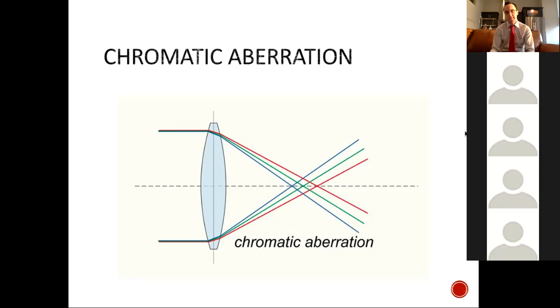And we may suggest the patient try a Trivex lens as an alternative. We also know that CR39 and crown glass have the least amount of chromatic aberrations. However, they have several issues in and of themselves, right?